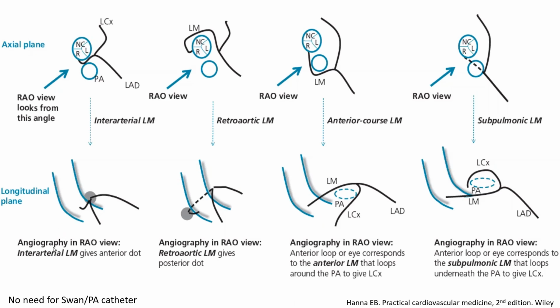If you want to remember one thing from this talk, it is this slide and this idea. If someone shows you an angiogram and asks you what is the course of the anomalous coronary, your answer should be, show me the RAO straight view, usually 30-degree RAO. Always image an RAO view, which will show you the anteroposterior spread of the aorta and PA.